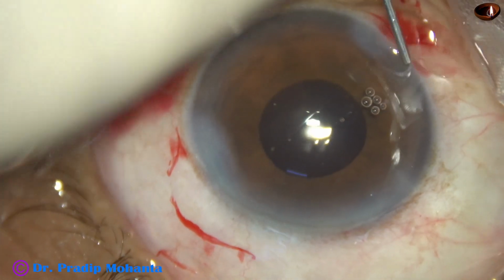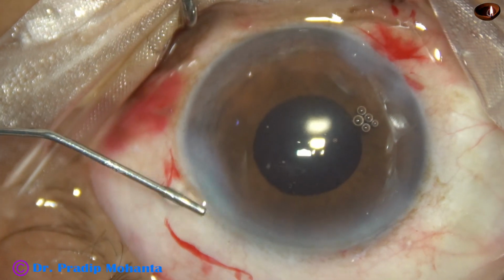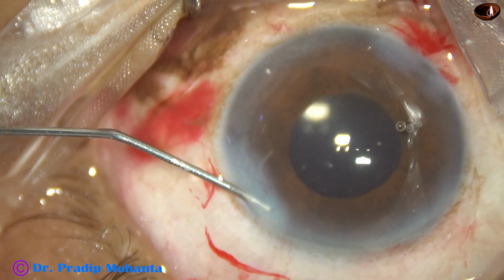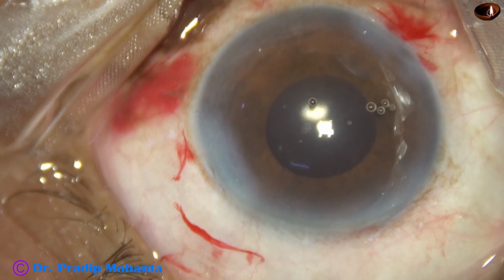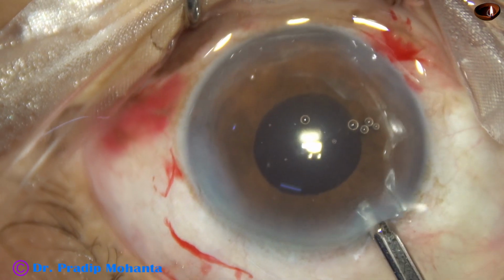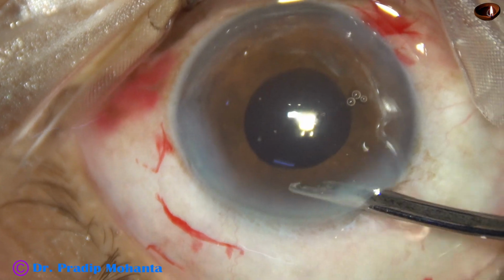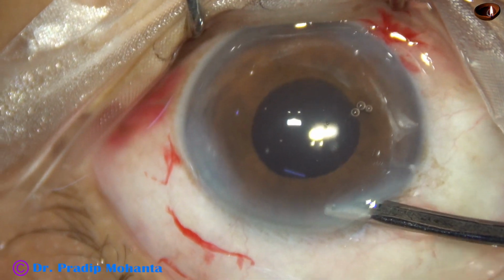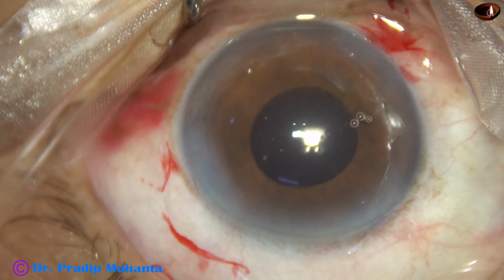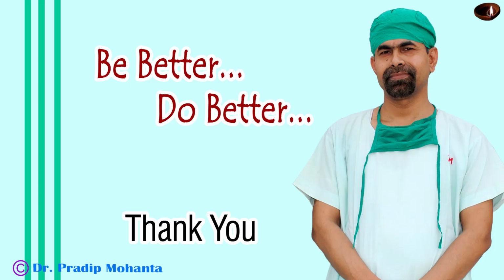This is closure of both the side ports by hydrating corneal stroma, and a final lavage of the anterior chamber is done with Simcoe cannula. The anterior chamber is nicely formed. Integrity of all the wounds are checked, and the case is concluded.